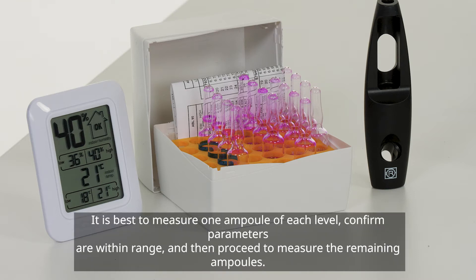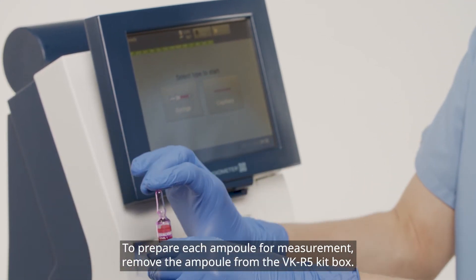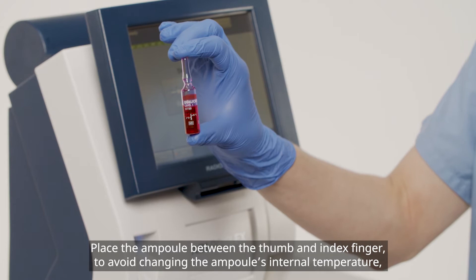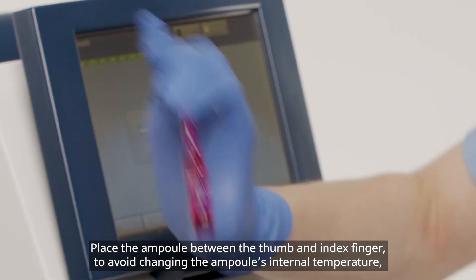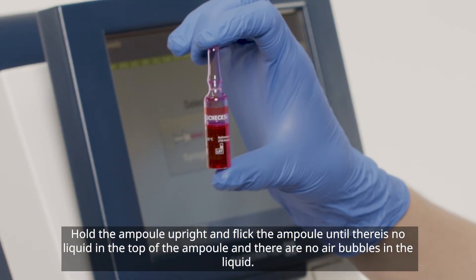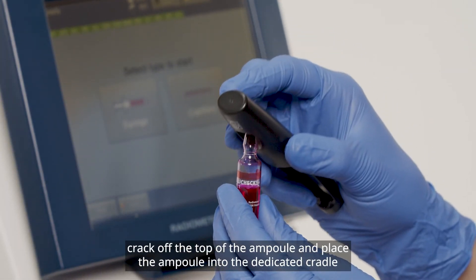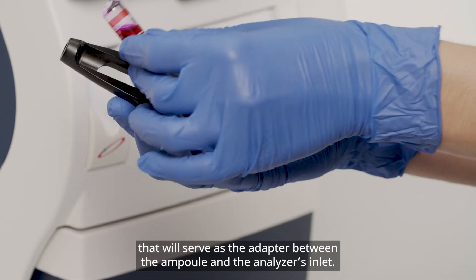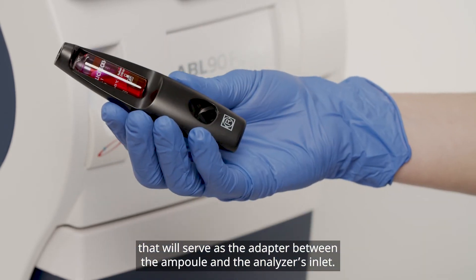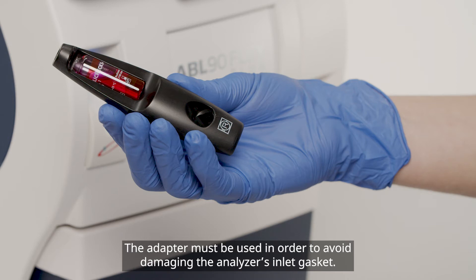It is best to measure one ampoule of each level, confirm parameters are within range, and then proceed to measure the remaining ampoules. To prepare each ampoule for measurement, remove the ampoule from the VK-R5 kit box. Place the ampoule between the thumb and index finger to avoid changing the ampoule's internal temperature, and shake the ampoule vigorously for 15 seconds. Hold the ampoule upright and flick it until there is no liquid in the top and no air bubbles in the liquid. Using the QualiCheck opener adapter, crack off the top of the ampoule and place it into the dedicated cradle. To maintain the reliability of blood gas parameters, you must measure the ampoule immediately after opening. The adapter must be used in order to avoid damaging the analyzer's inlet gasket.